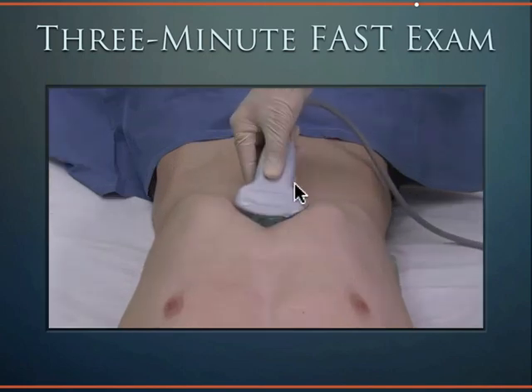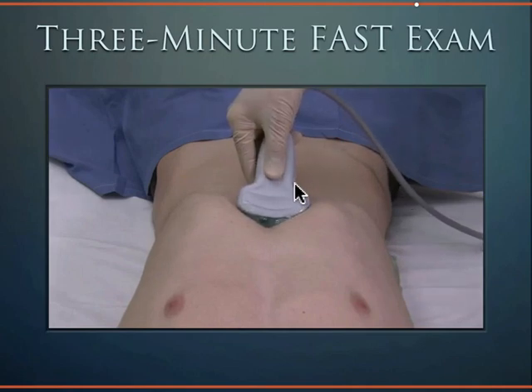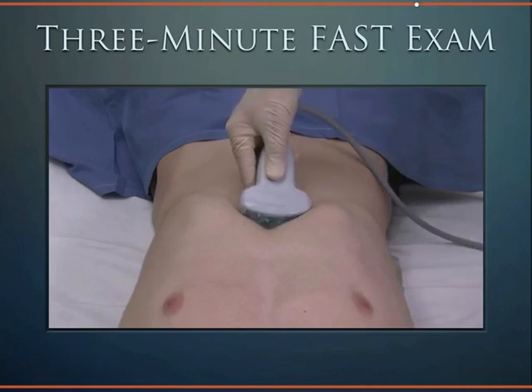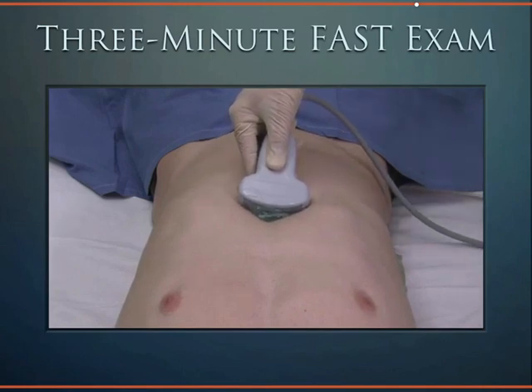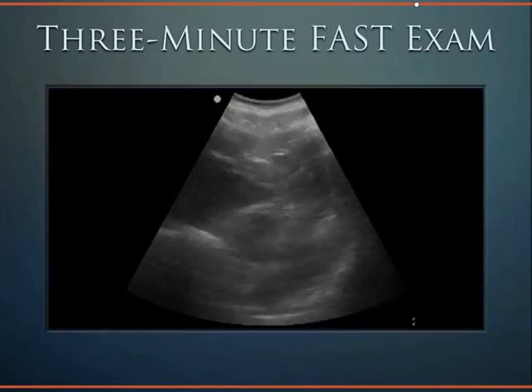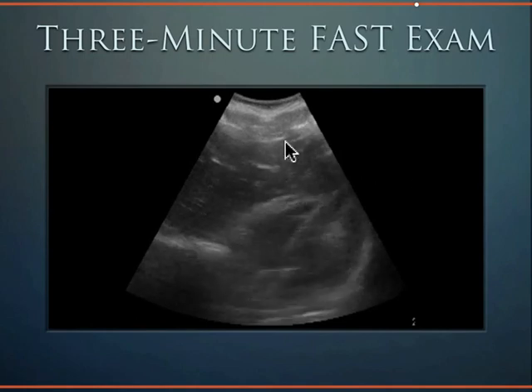Ensure that the indicator is towards the patient's right and the cable exits the bottom of your hand. Fan the transducer and apply more pressure as the patient takes a deep breath. The heart should come down your screen.